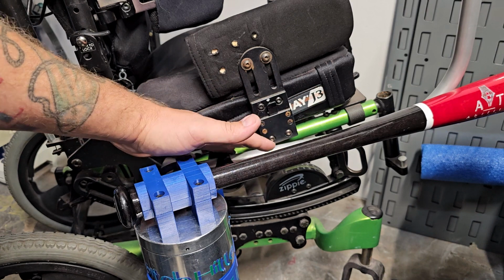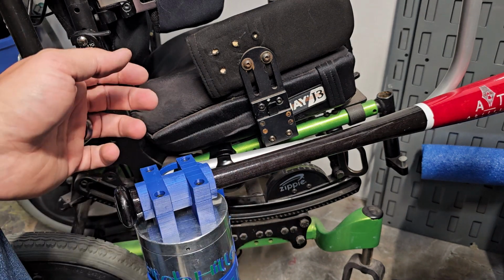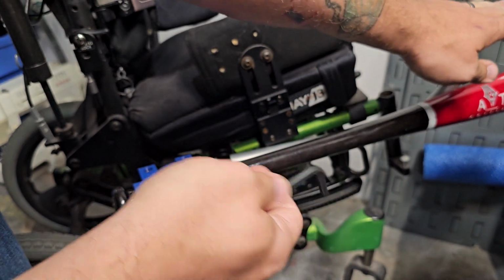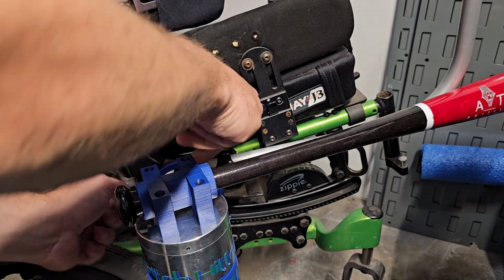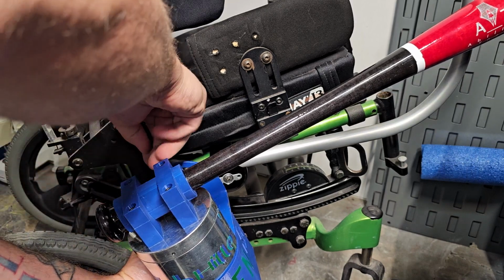So we have it mounted to the wheelchair. Now we just need to make some final adjustments. So what we want to do is you take and loosen up the switch hitter, and you want the bat to sit in about the middle of this bar. Okay, so we'll loosen up the switch hitter and we'll raise it up to about roughly the middle.